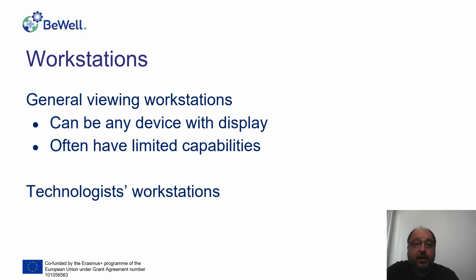And there are technologists' workstations. They are next to the devices, and they are used by the technologists for checking the patient's data, the protocols, and then to verify the images that are acquired.